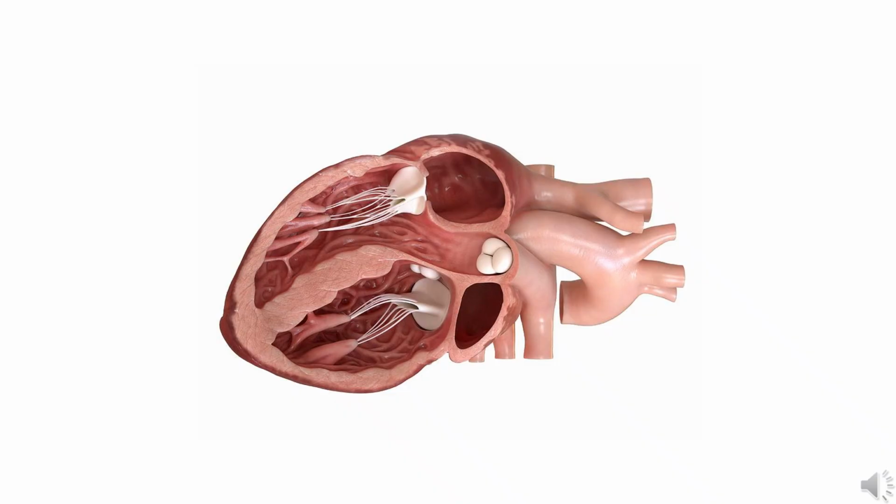If you rotate the image 90 degrees to the right, this is basically what the parasternal long axis view looks like. Apex of the heart towards the left of the screen, and aorta to the right of the screen. Get used to looking at the heart this way in the beginning, because you will be practicing the parasternal long axis view for a while, before you move on to the next view.